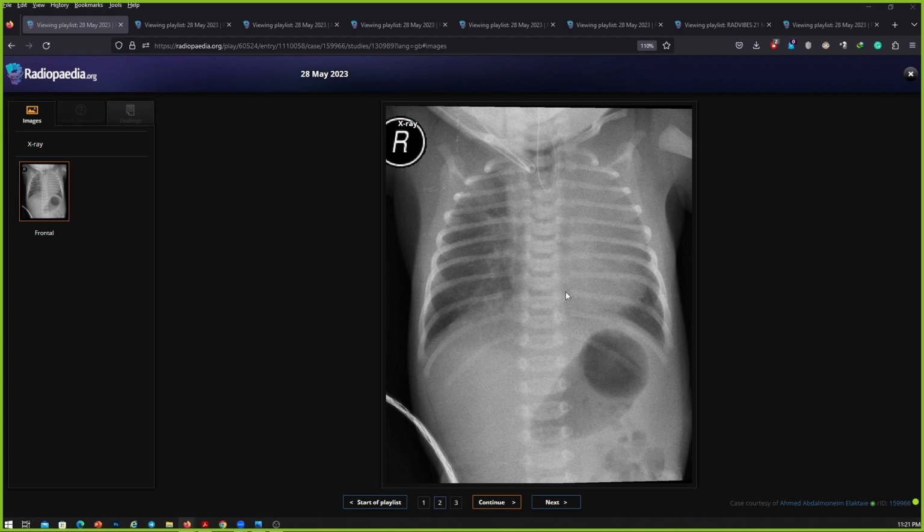But you should know that in an isolated esophageal atresia, you won't find gas in the abdomen. Other than that, you did well. I would suggest you keep practicing more and try to do more cases as you go. Overall, well done.